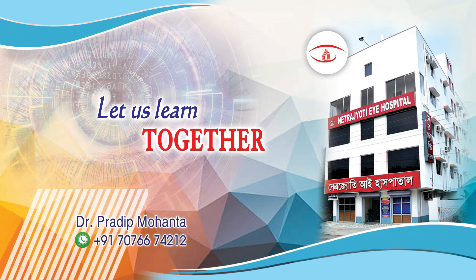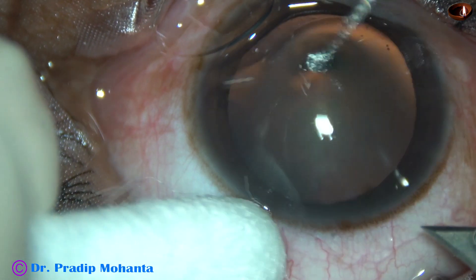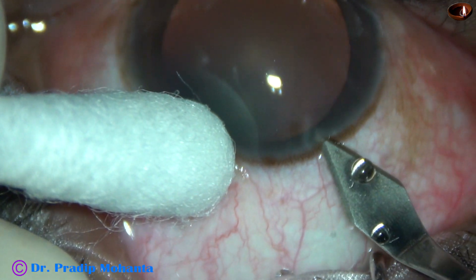Friends, welcome to my workplace at Ranaghat, West Bengal, India. Rhexis ran out in this case. Let us observe how it happened and how the case was managed.